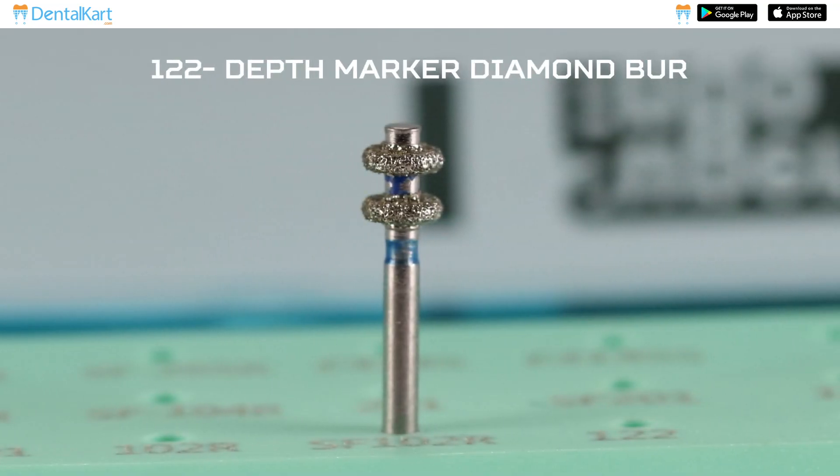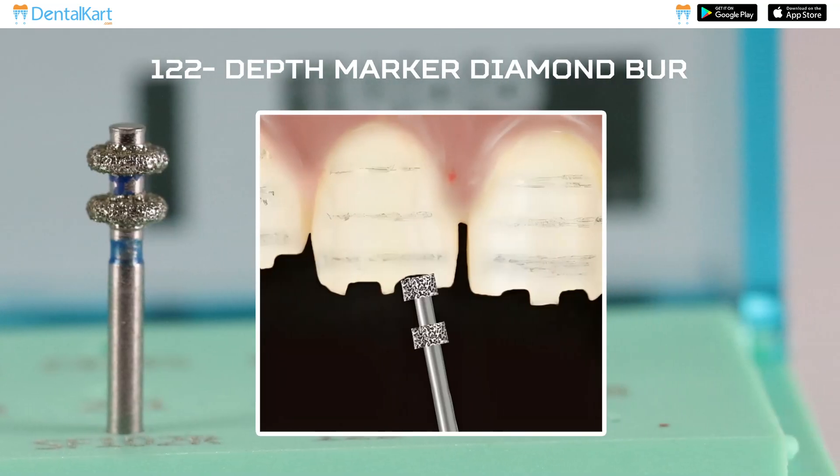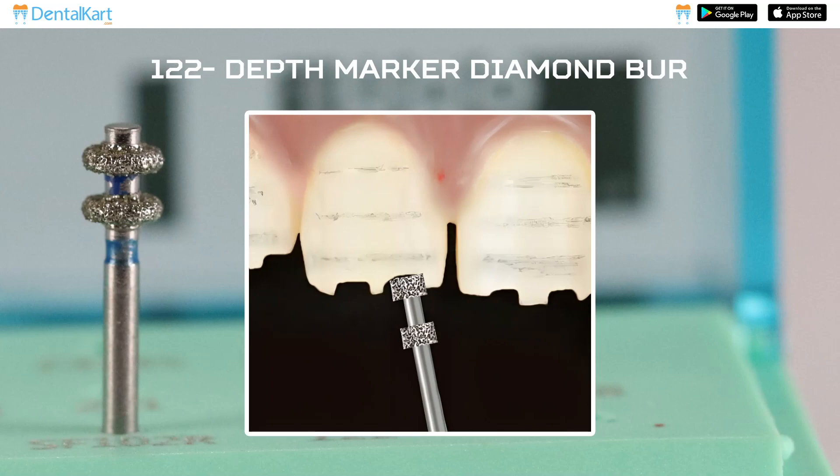1-2-2 Depth Marker Diamond Burr: This is used for making guide grooves on the facial and buccal surface of the tooth for initial depth cutting to prevent over cutting.